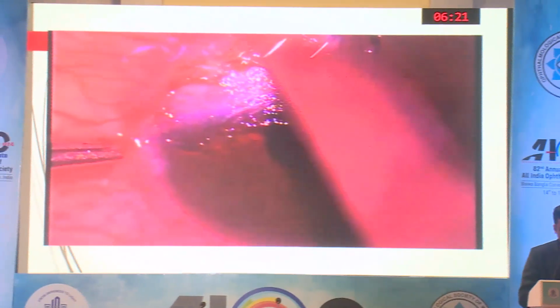You can mix and match so that it goes well with the color of the other eye. For Indian eyes, it's quite easy because they are heavily pigmented. For Caucasian eyes, it's a challenge to get the accurate shade.